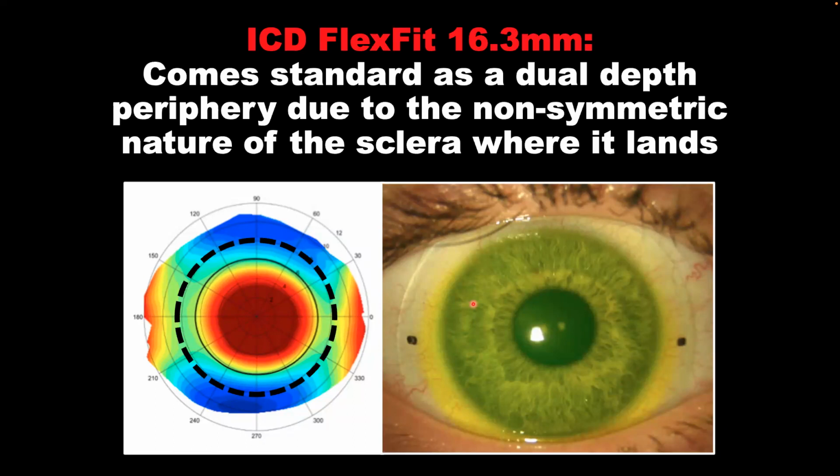Just rotate the lens 90 degrees, tell the patient to blink, and see if the lens really returns to that position that you noted at first. If it does, then you have a very stable lens and you wouldn't have any issues. But if it doesn't, then you may need to address the landing zone, and you may even need to change toricity. You may request more toricity, less toricity. It will depend on what you're finding.